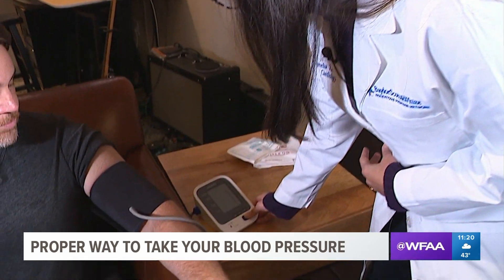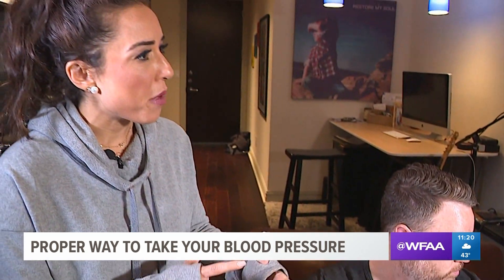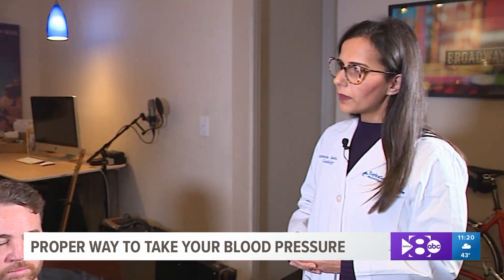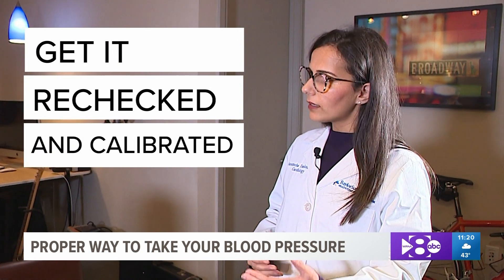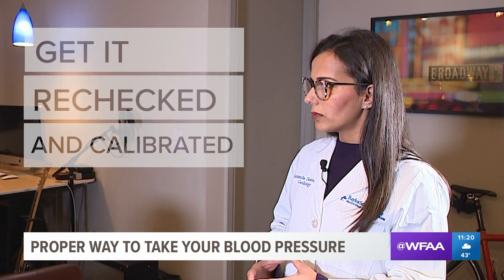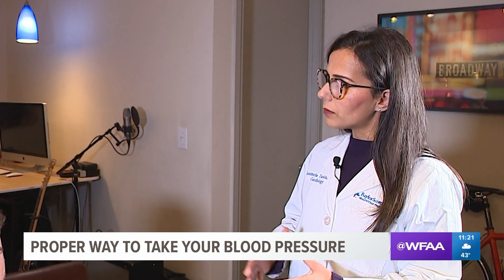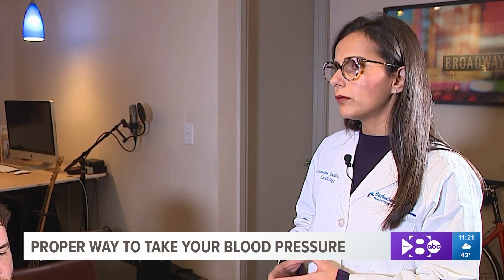As for the measurement method, many people ask about electronic versus manual. At home, an electronic arm cuff is good enough. But it's important to bring your machine to your doctor's office to get it rechecked and calibrated so that it's giving you accurate readings. A manual blood pressure recording is considered the best and most accurate form in a physician's office if done correctly. You want your home machine readings to be within a couple of points of your doctor's readings.